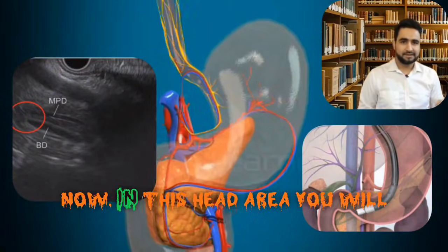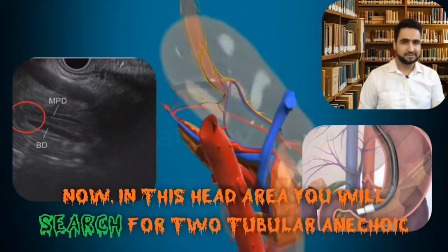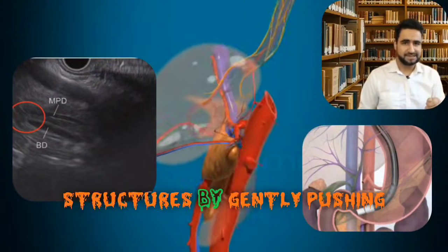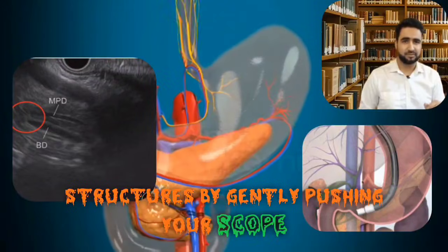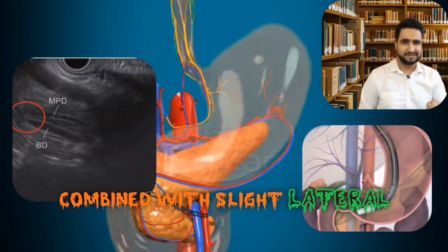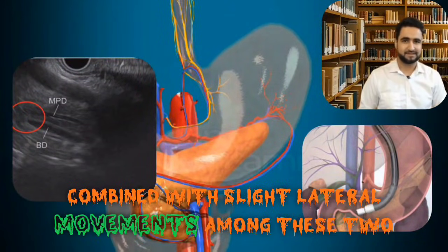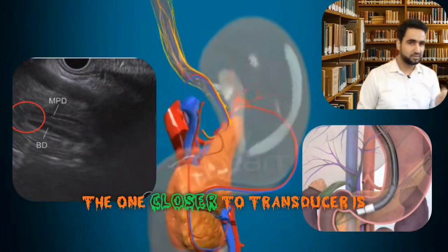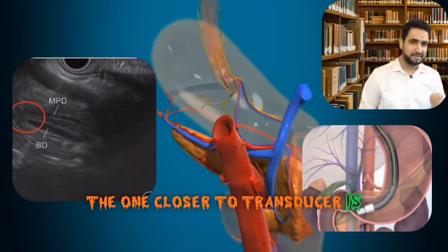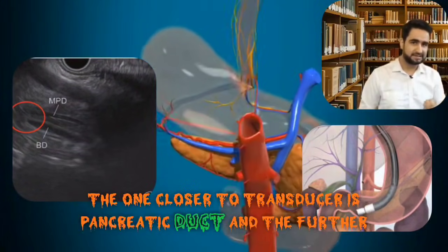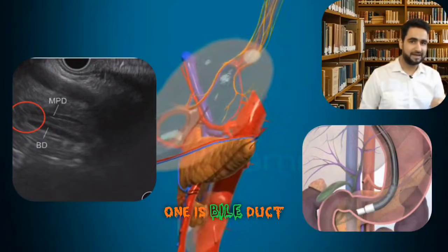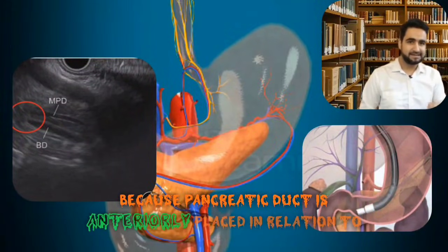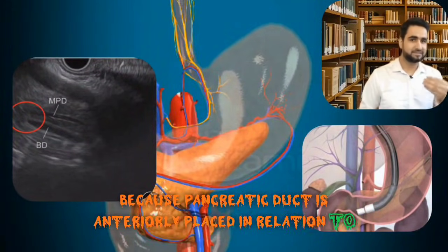In the head area, search for two tubular echogenic structures by gently pushing your scope combined with slight lateral movements. Among these two tubular structures, the one closer to the transducer is the pancreatic duct and the further one is the bile duct, because the pancreatic duct is anteriorly placed in relation to the bile duct.